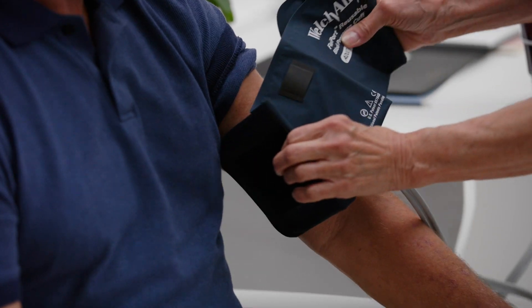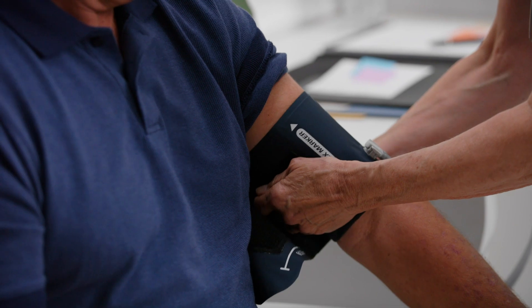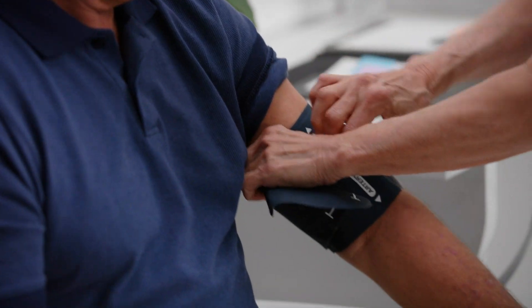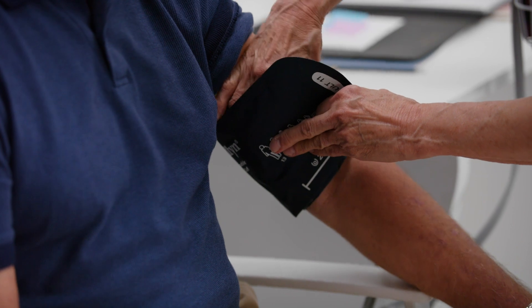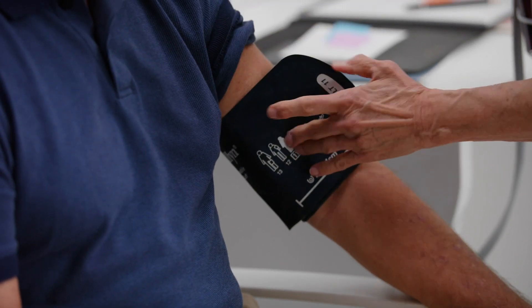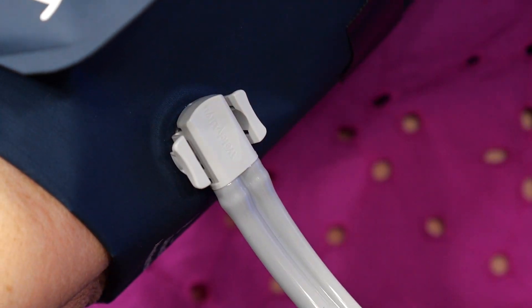Third, attach. At this point, you have positioned your cuff properly and chosen the appropriate size cuff for your patient. You are now ready to attach your blood pressure fitting. With FlexiPort technology, snap the fitting from your blood pressure device directly into the cuff and wait for the click sound.